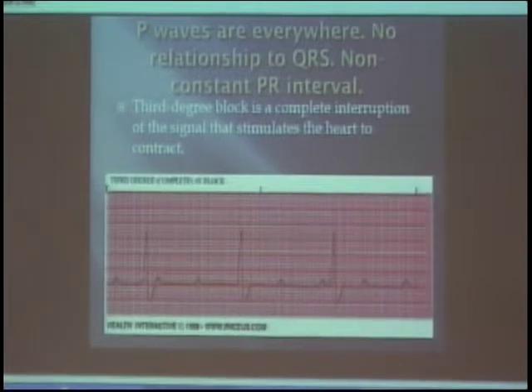Now here comes the most serious of the blocks in relation to bradycardia. The P waves are everywhere. There's no relationship to the QRS, and there's no constant PR interval. It is a complete interruption of the signal that stimulates the heart to contract.